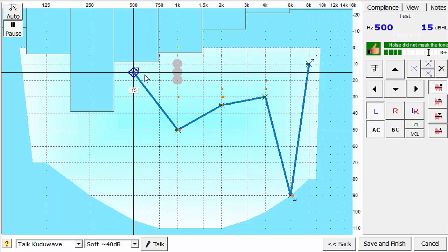Then you've got information that you can use to interpret the test results. If it's important to actually test quieter, to lower thresholds, then you have to redo that test. But usually you have to decide clinically, if they could not, for instance, get to 0 or to -10, what the effect will be on your clinical diagnosis.